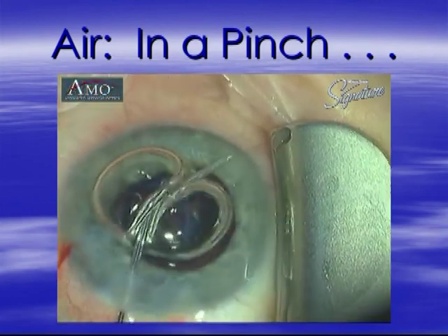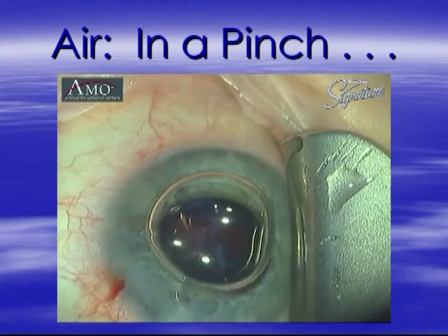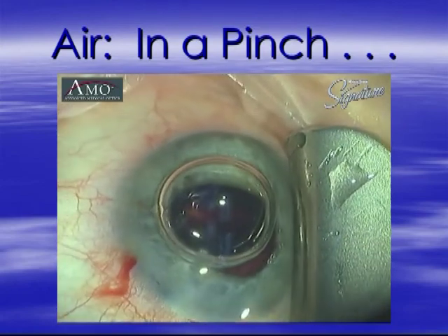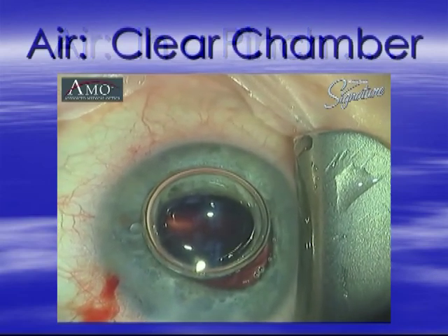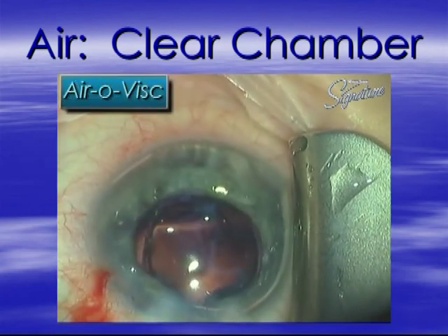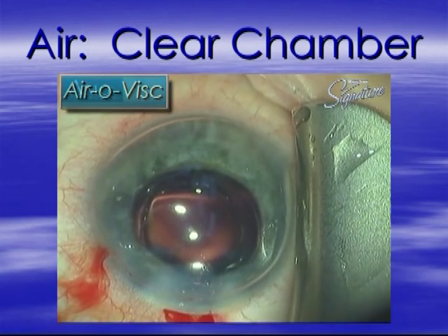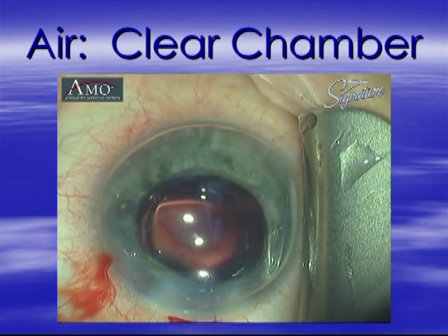The nice thing about displacing this mixture out of the eye is that the viscoelastic cannot hide in the air. Now, pretty reasonable to expect that as I irrigate more and more, I'm going to get this viscoelastic out, but how do you really confirm it? Well, we're going to put an air bubble in again, a little more Aerovisc. And this time we're going to try to distend it all the way till the anterior chamber is relatively full. Now you can see the bubble almost conforms completely to the anterior chamber.